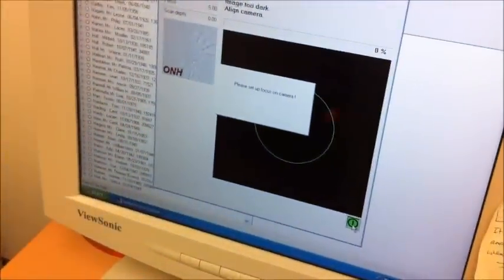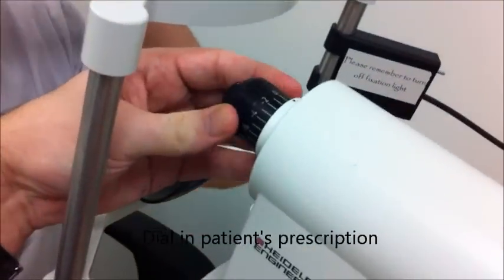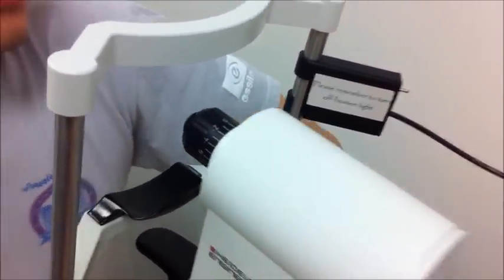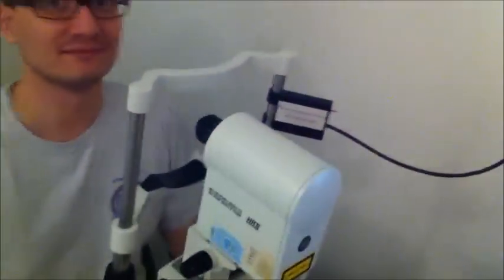You'll hear a high-pitched noise from the machine, that's quite normal. On the little dial here, you can actually dial in the prescription of the patient. When I start the scan, I just move that until the image gets as clear as possible. So we're going to turn down the lights. I'm going to ask you to pop your glasses off for me, and I'm just going to wipe the chin rest first.